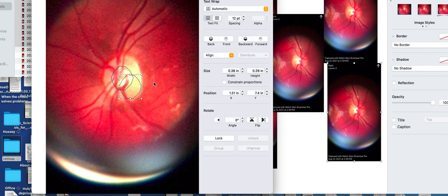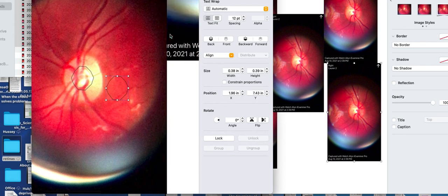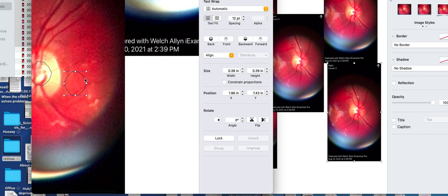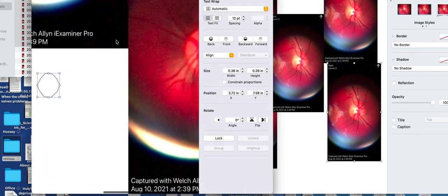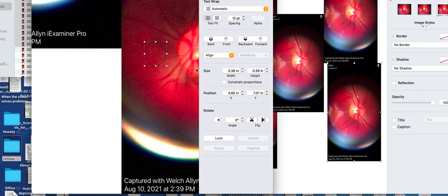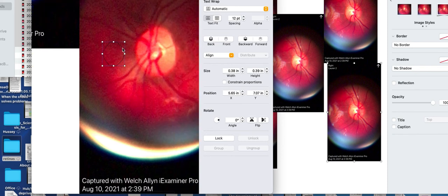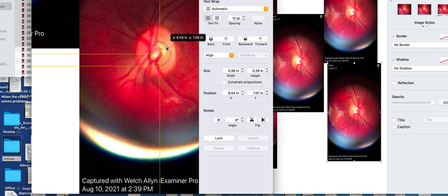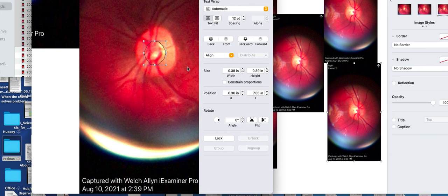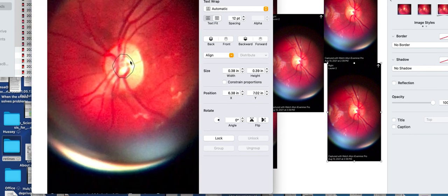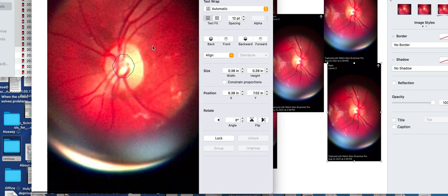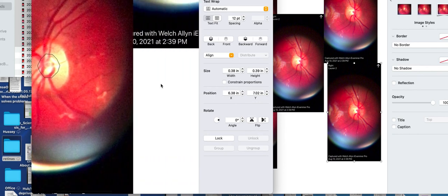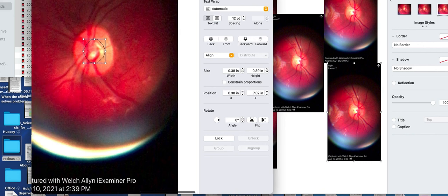I duplicate that, and I can just move this over. I know this is the same eye, but you get the idea if it's year to year. Just based on the differences in the pictures, you get a little bit of difference in how you might want to draw the cup. You can see that I'm a little outside the edge of the cup there. So in my finicky nature, would I probably change the sizes on that? Yeah, a little bit. But you get the idea.